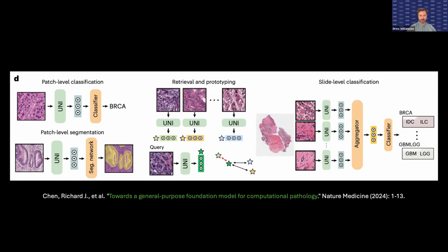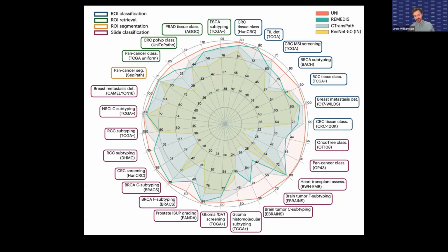And so again, unfortunately, these deep learning-based features come from an individual patch, and then you have to have some subjective method of combining all the individual patch features, aggregating them somehow, to get a deep learning-based feature for the whole slide. And so maybe for your human interpretable features, that feature for the whole slide might be like a distribution of the value of those features, something like that. And here you can have very complicated aggregation functions. And we show that our model is good and does better on the tasks that we chose than some other models.